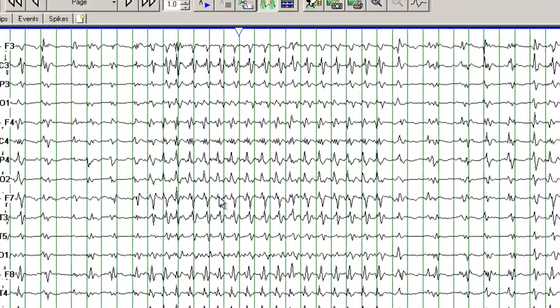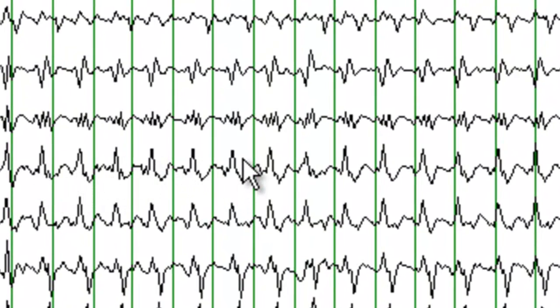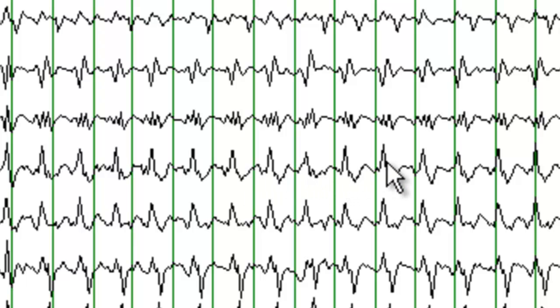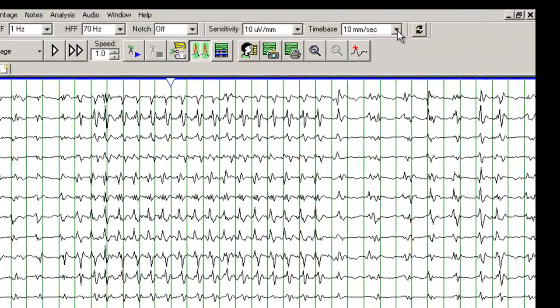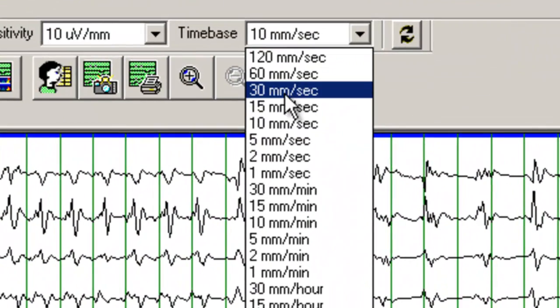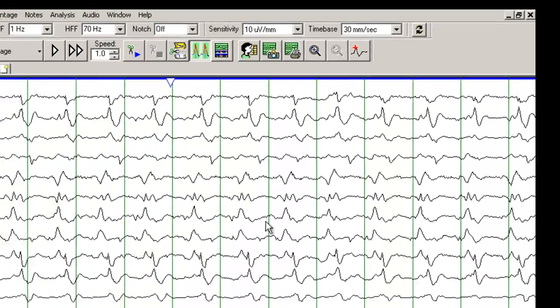With compressing this EEG, the periodicity becomes more obvious. So you see that these discharges, these sharp waves are occurring more or less at an interval of one second. Let's go back to the 30 mm per second time frame.